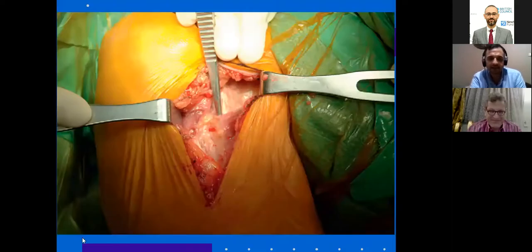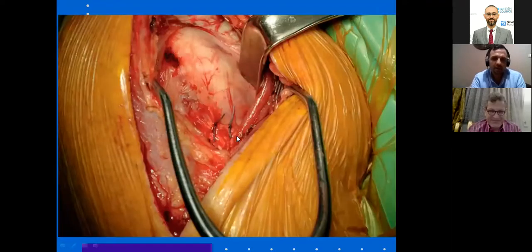Here, this is the pectoralis major. You have to resect some fibers to get a wide view. And here, these are the three sisters, 2 veins and 1 artery. You should ligate them. And then this is the subscapularis.